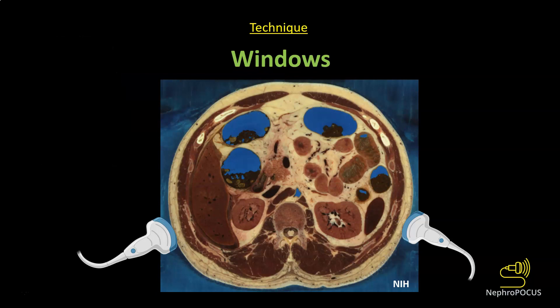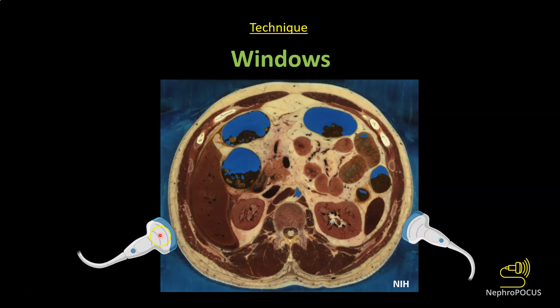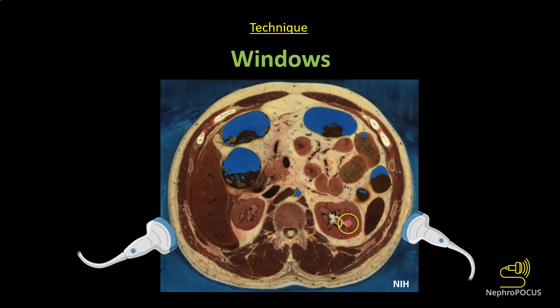We use liver and spleen as the windows to look at kidneys. The right kidney is visualized through the liver and the left kidney is visualized through the spleen. Liver is a big organ, so even if you move the probe anteriorly — even more anterior than the anterior axillary line — you should still be able to visualize the kidney. On the other hand, if you move anteriorly on the left side, you encounter bowel gas which obscures the view.